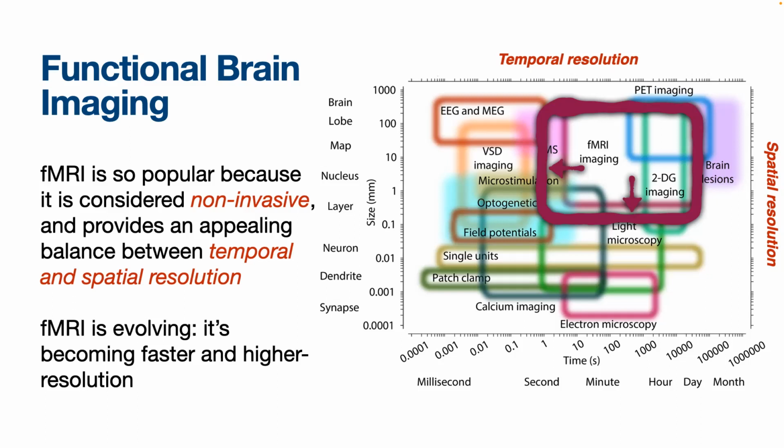And it really constrains the type of experiment that you can do. I'll show you later on how horrible movement is for MRI. The padding, for example, and the instruction to not move, they're not there for nothing. They're a really prominent feature of what you cannot do with fMRI. Exactly. Anyone else? Another thing that you cannot do with fMRI. If you look at this square.